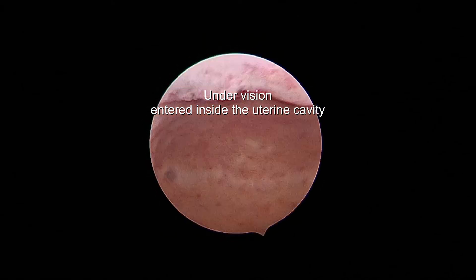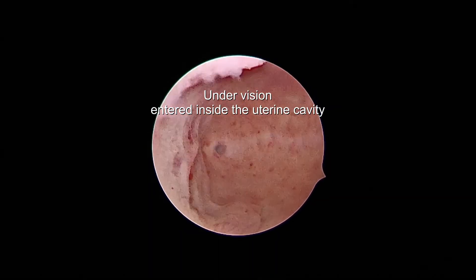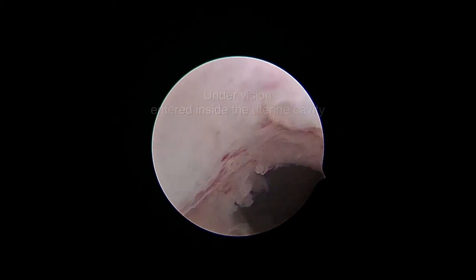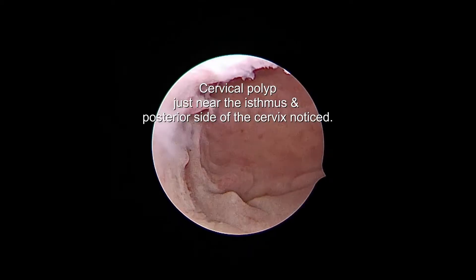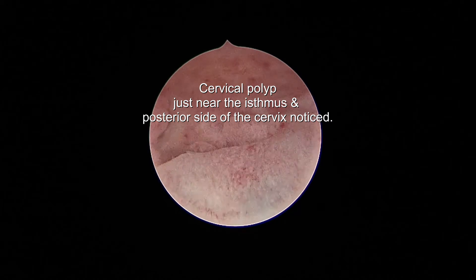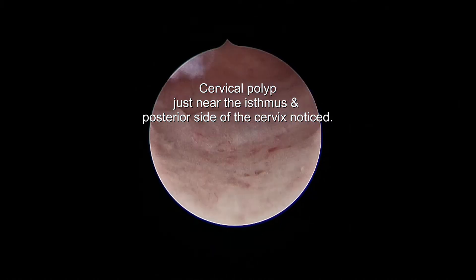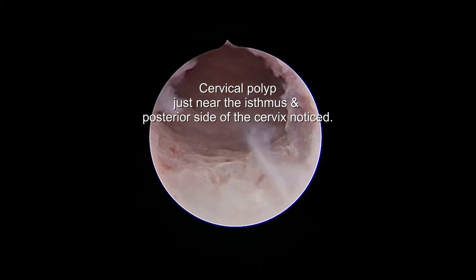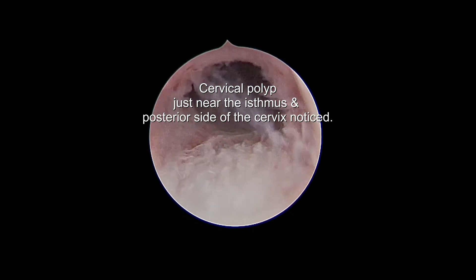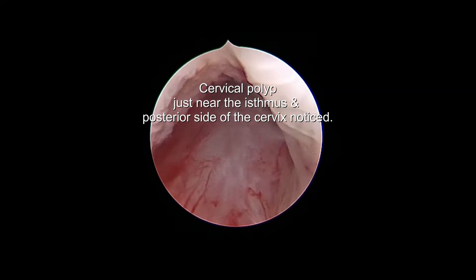You get a clear picture — the right tubal ostium and the uterine cavity, the left tubal ostium and the uterine cavity. You can see that this polyp is not in the uterus but just near the isthmus. I am trying to find out the base.